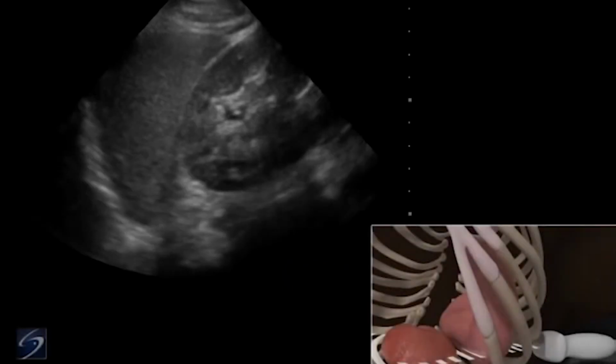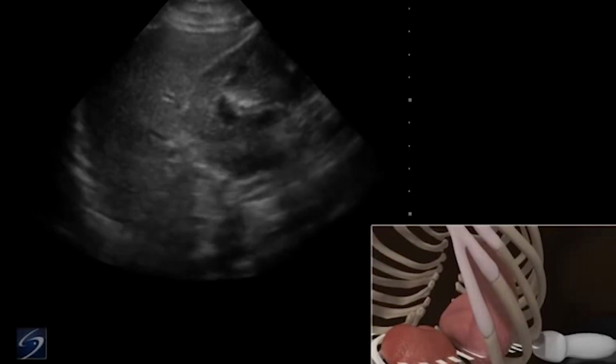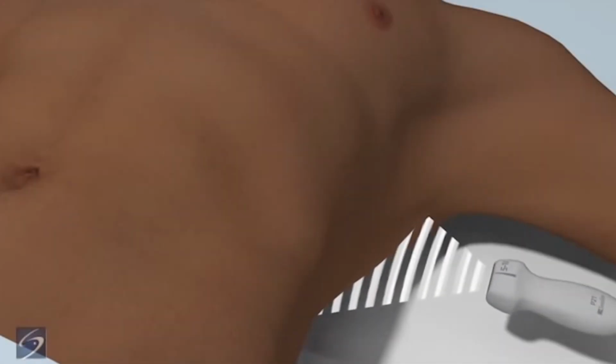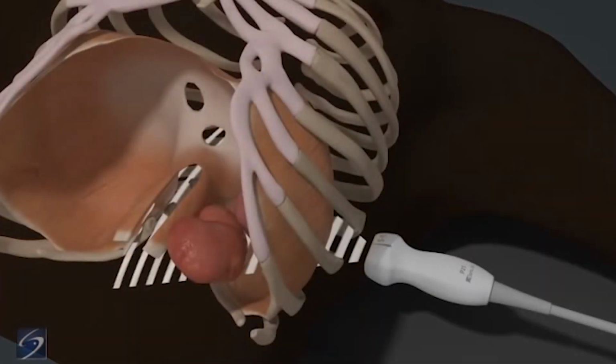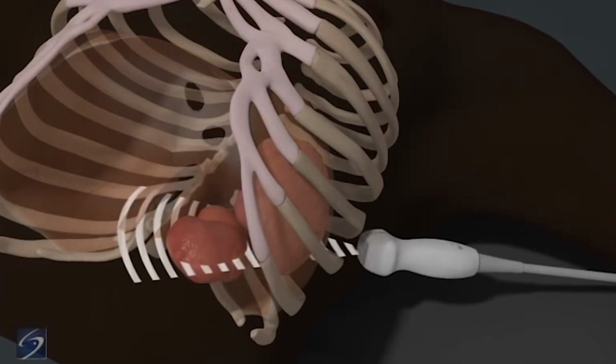A phased array transducer with an abdomen exam type is used to perform the left upper quadrant view of the FAST exam. The orientation marker is directed toward the patient's head. The transducer is placed in a long axis orientation along the left posterior axillary line between the 5th to 7th intercostal spaces. The sonographer's hand will touch the gurney with the proper transducer position. Rotation and oblique positioning of the transducer will help eliminate rib shadows.